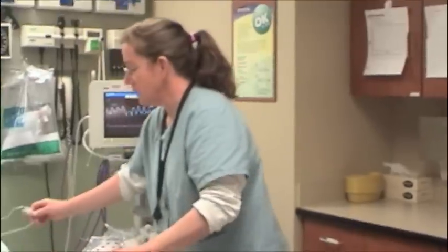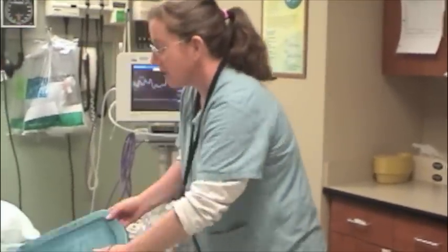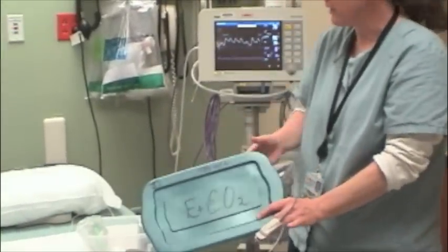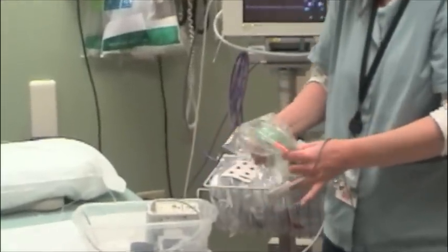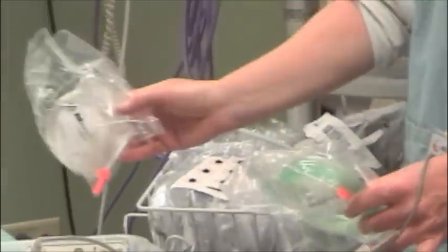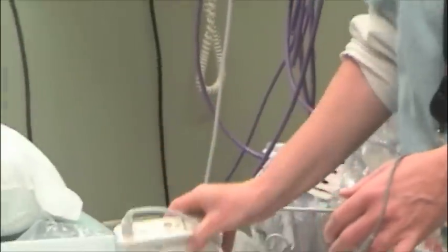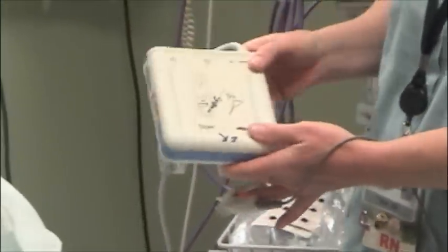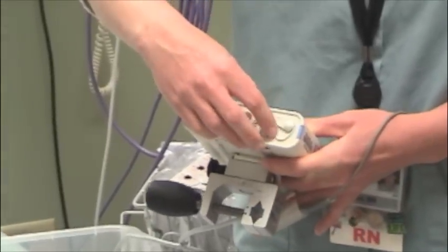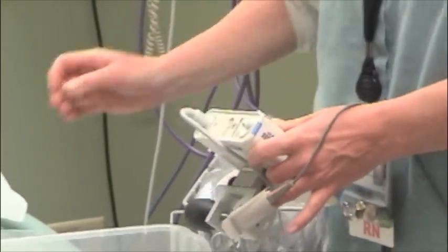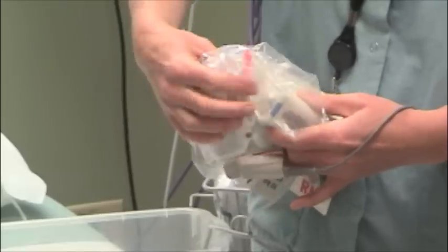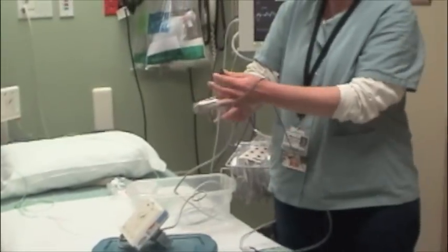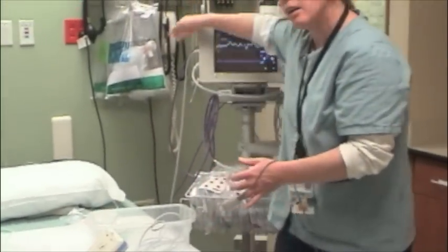Now I'm going to talk about how to set it up. Our end-tidal CO2 boxes are kept in trauma 1 and trauma 2. They look like this under the heading of capnography. They each have pediatric and adult cannulas, as well as one that will fit on an endotracheal tube. They come with a calibrator, which you can clamp onto any IV pole or the bed frame. There is a small hidden switch right here. You insert the orange end and screw it into the hole, and the cable is color-coded.